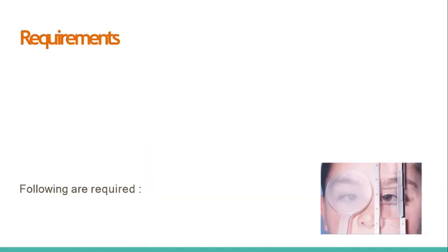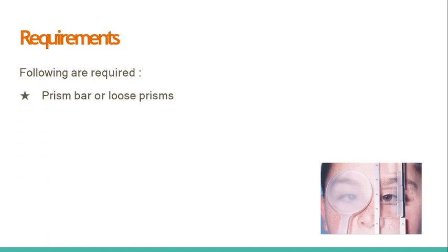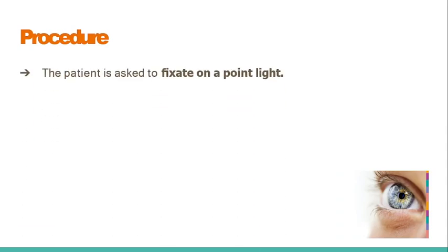Requirements. Following are required: prism bar or loose prisms, pen torch, patient, examiner. Procedure. The patient is asked to fixate on a point light.